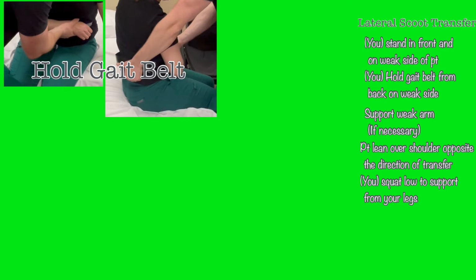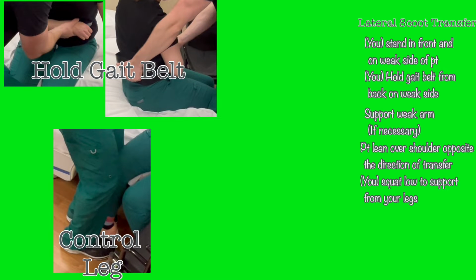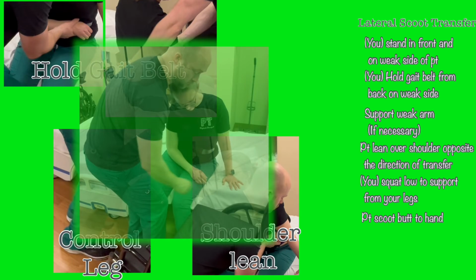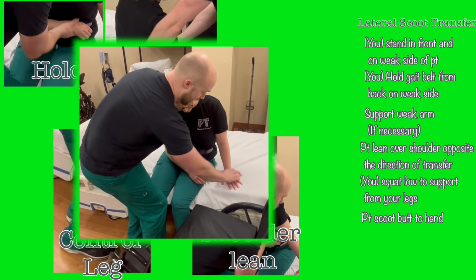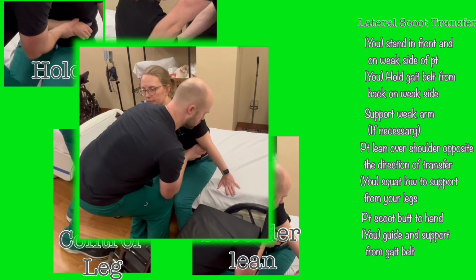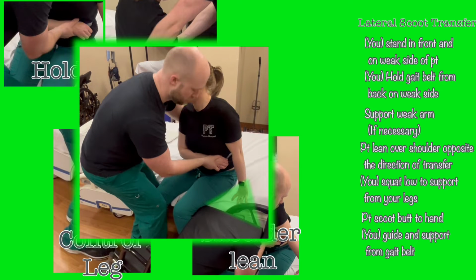While you're holding the gait belt, blocking or bracing the weak leg, and directing the patient to lean over your shoulder, direct them to scoot their butt to their hand. They should push up with their strong side as you aid and support from the gait belt. Just a short scoot toward the chair, and position the patient angled toward the chair if possible, instead of at a 90-degree angle to the chair. It'll make the next scoot easier.